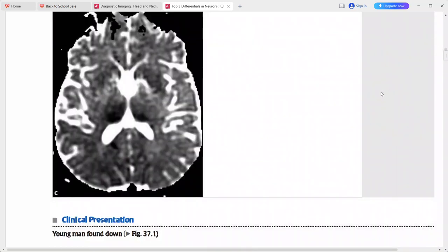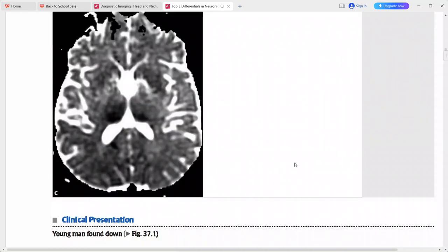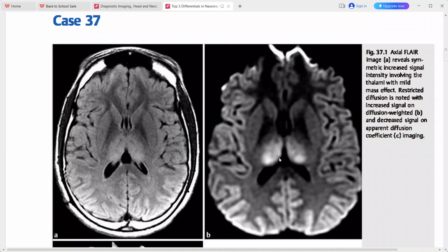This is a young man who was found unconscious. FLAIR MRI shows symmetric increased signal intensity involving the bilateral thalami with very little mass effect. On DWI and ADC there is corresponding diffusion restriction. Bilateral thalamic signal abnormality in a young adult found down — the top diagnosis is infarct.